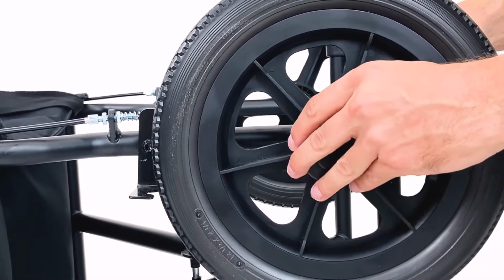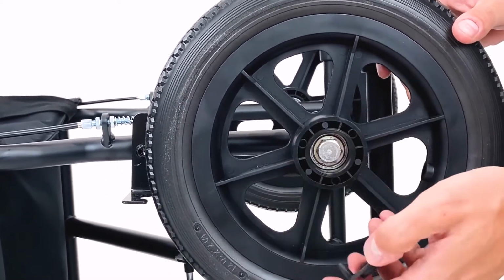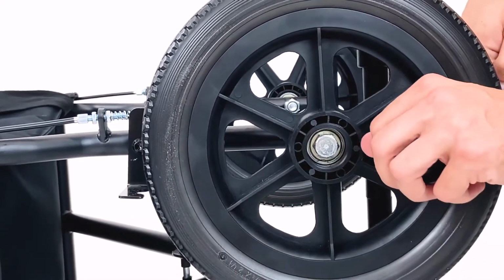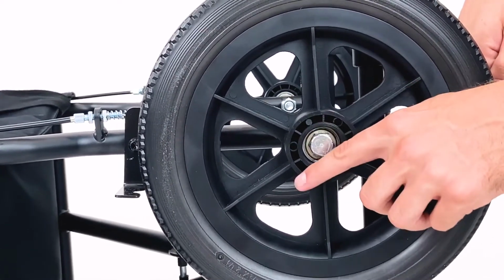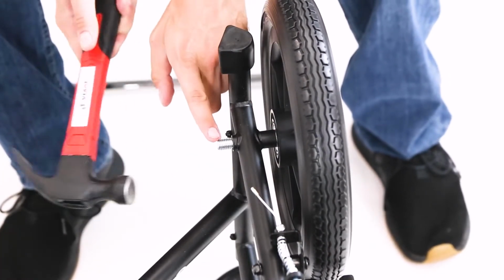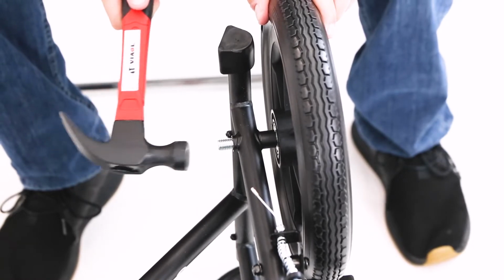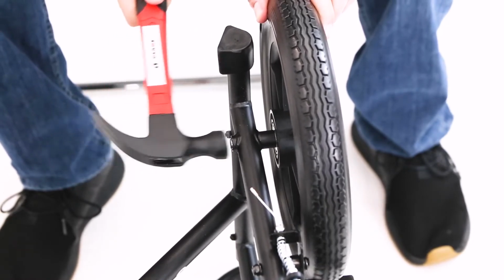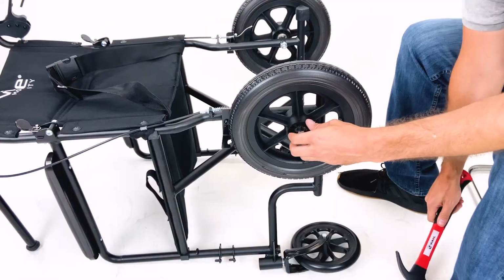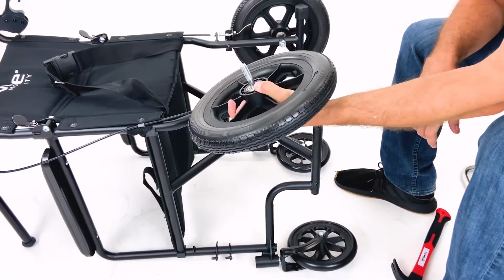The second step will be to just take off this cover here, which this one comes off pretty easily. Sometimes you might need a flathead screwdriver or something to help pry it off, but you'll want to be able to get in so you can get this bolt out. The third step will be to take a hammer and just gently knock this bolt through. So that way you can remove your wheel.